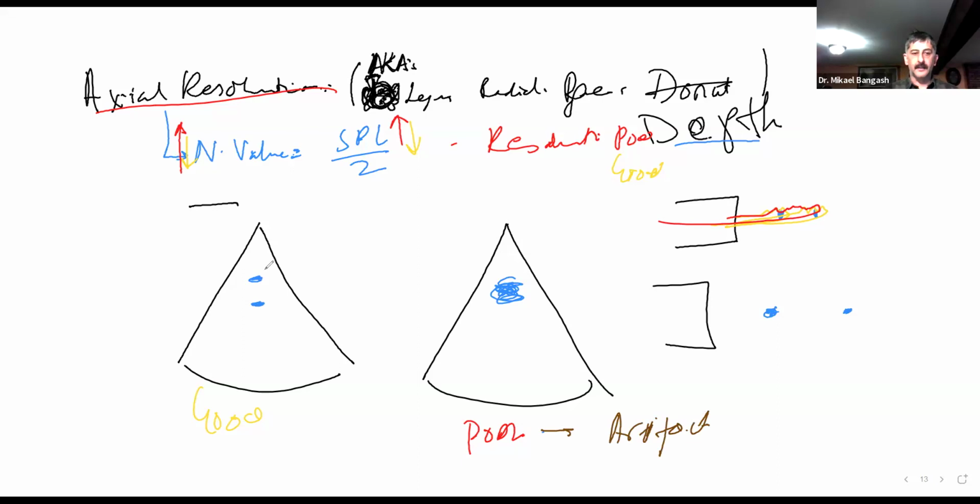Maybe actually we can say, in this case there will be an example where the number of reflectors is not real. We had two reflectors, but they appear as one. Mirror imaging, refraction, and lobe artifacts, for instance, are examples where the number was still wrong. We call one appearing as two. Did you guys get that?